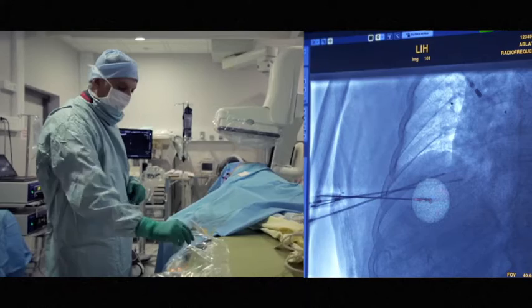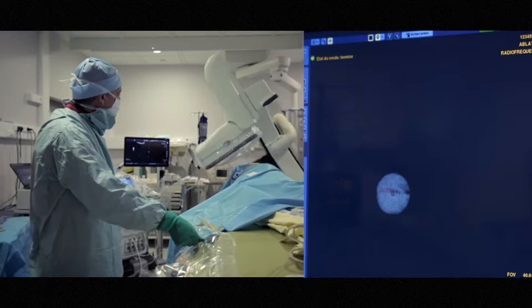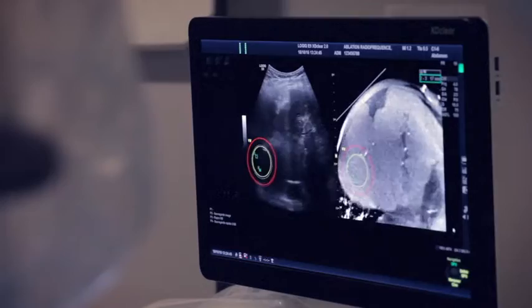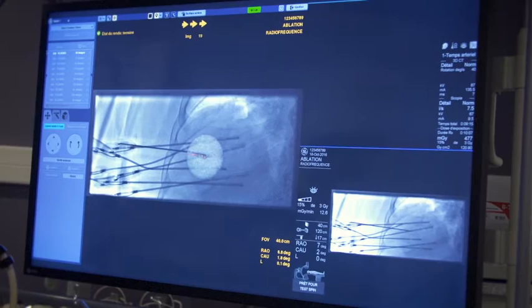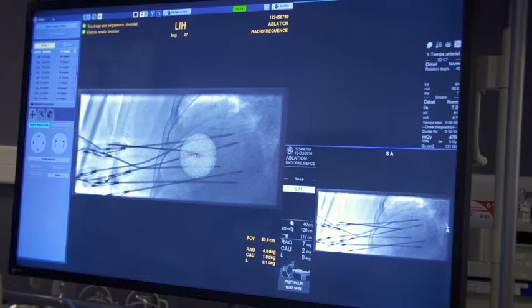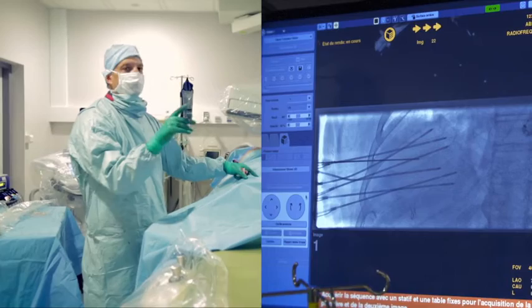We have now placed an electrode using ultrasound mode. We check its position with respect to the target previously placed in the initial cone beam CT, verifying the front and profile view to ensure the 3D position of the electrode around the tumor. We then ensure the continuity of the ablation by measuring the 3D distance between the electrodes using the Logic E9. Once all the electrodes are in place, we use needle assist with stereo 3D to determine the 3D position of the electrodes in the initial cone beam CT.